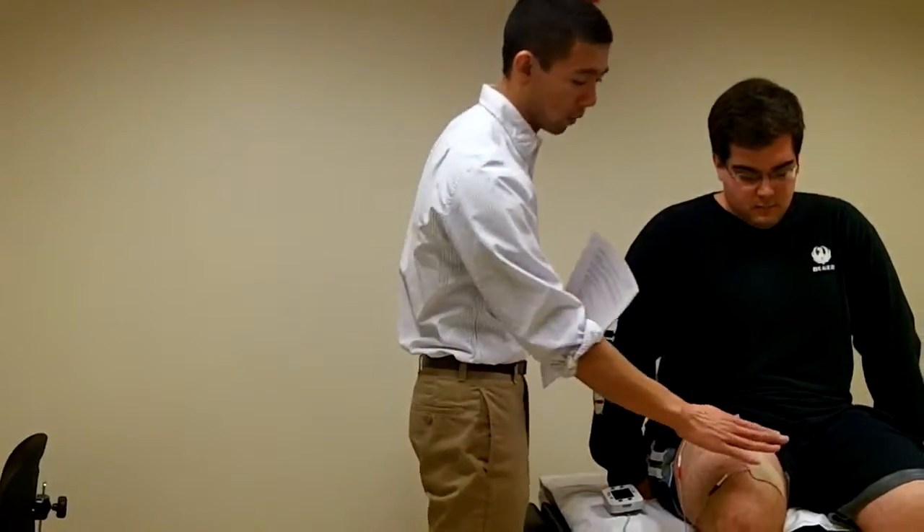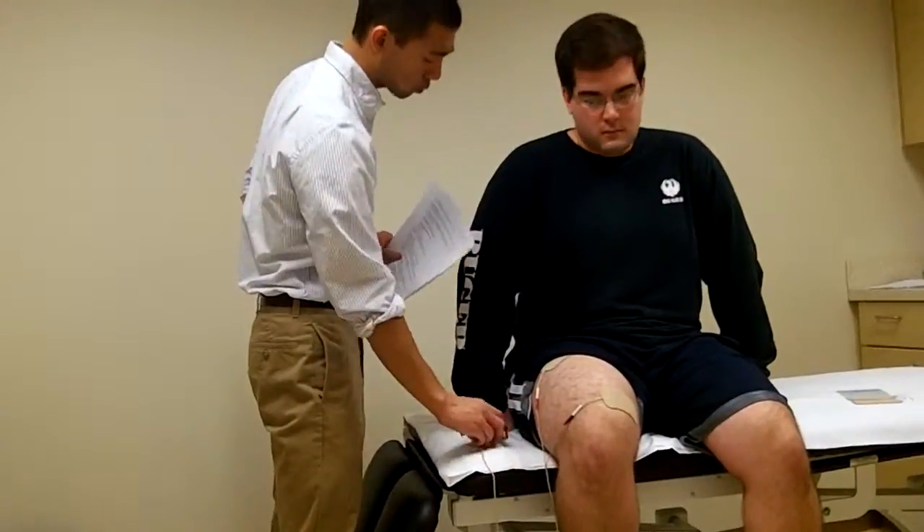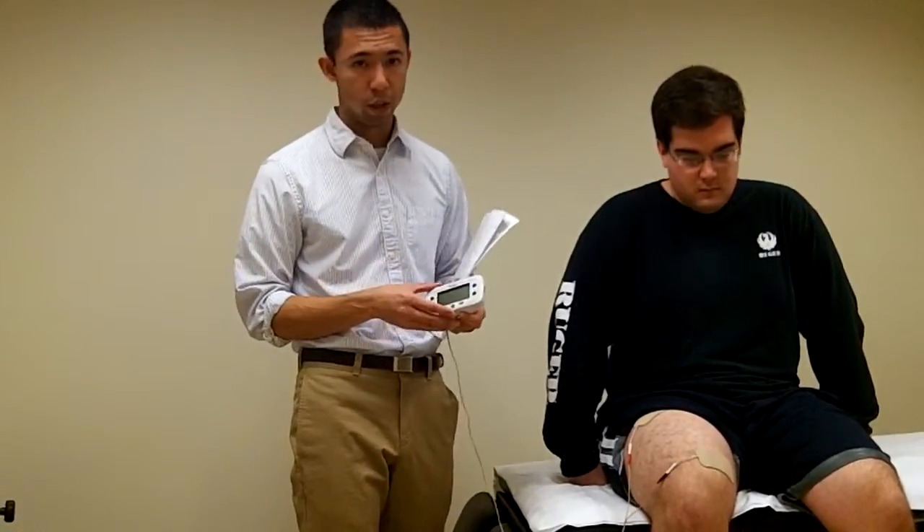So again, very similar in size to what is being used in this demonstration. All those parameters can be adjusted in the custom settings of this portable MP unit.